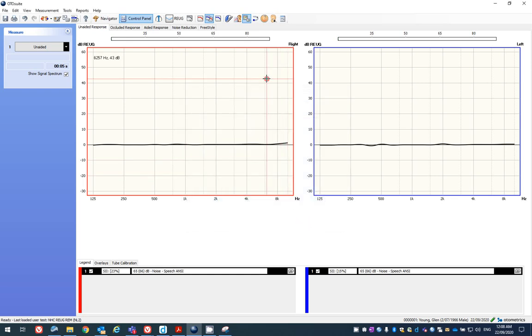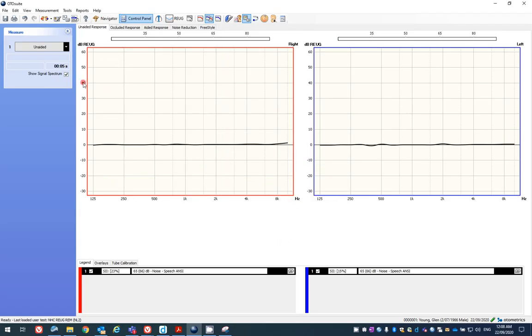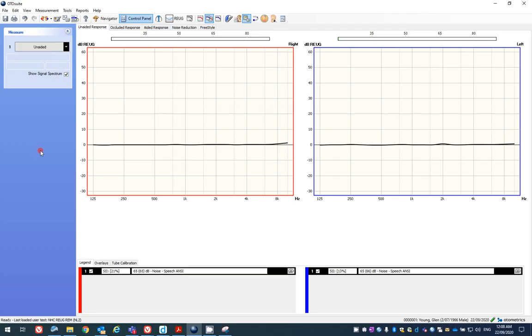So the steps for testing everything would be: first step, room calibration. Second step, tube calibration. Third step, unaided trace. And that is perfect. We're ready to go.